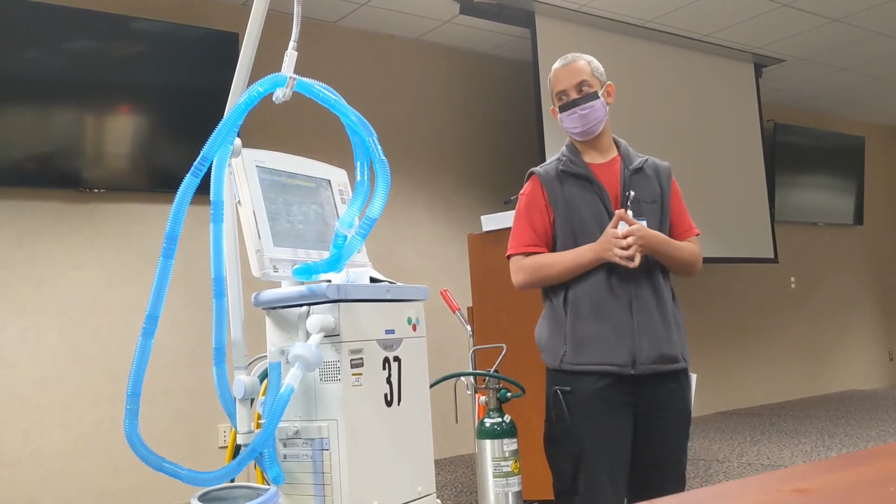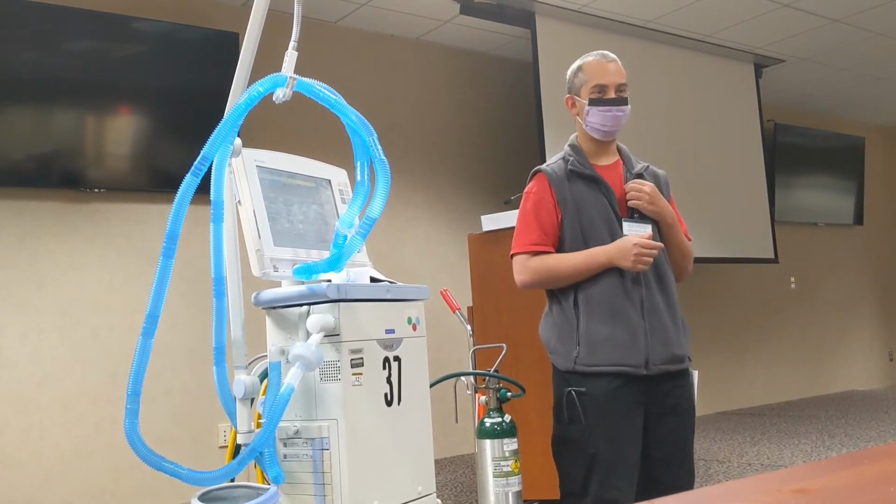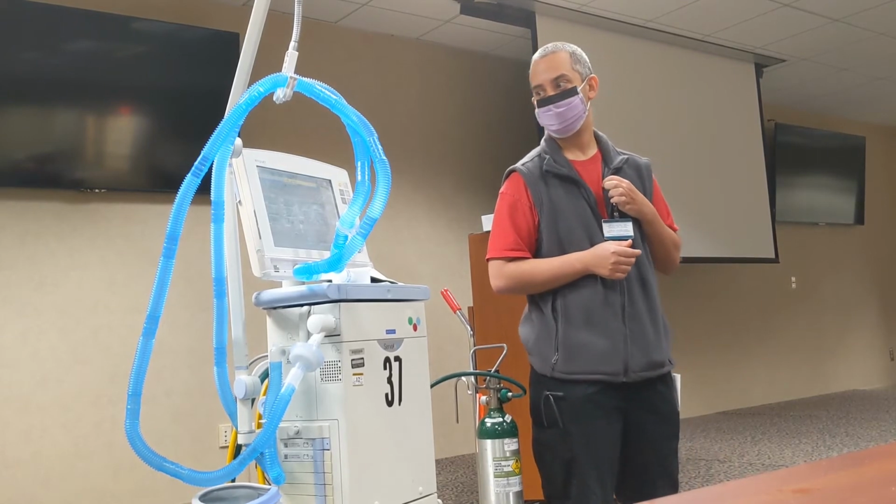Most of the time, you can solve that problem by going down on your T high.